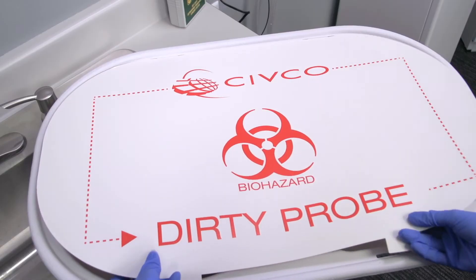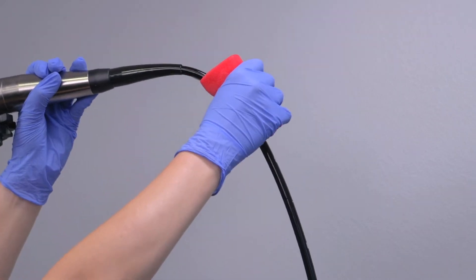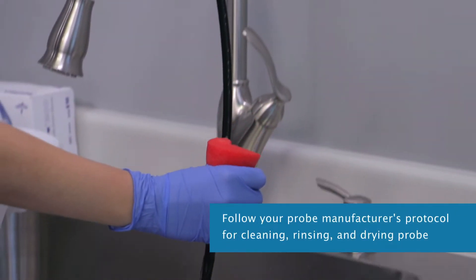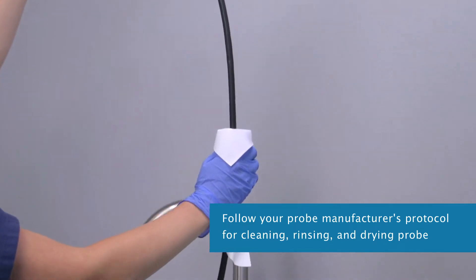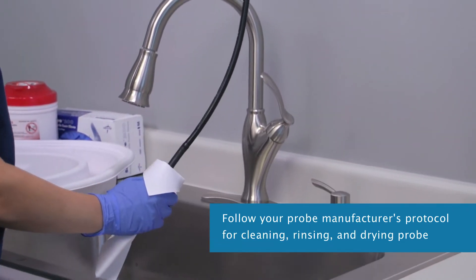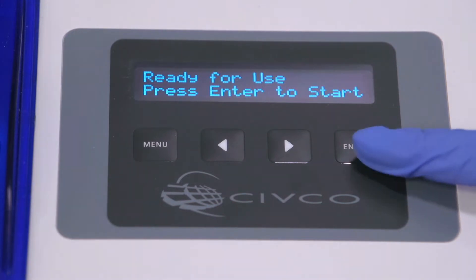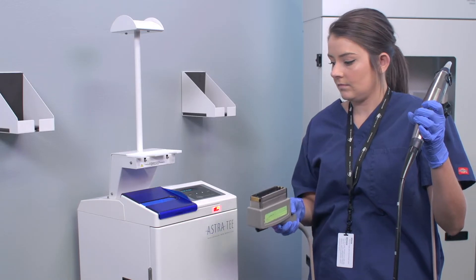For daily use, disinfect your TEE, endovaginal, and endorectal probes following your manufacturer's protocol for manually cleaning, rinsing, and drying your probes. Once ready to disinfect in the Astra, the display switches back and forth from 'Ready for Use' — press Enter to start — and 'Ready for Use' showing the date and time. Scan the probe connector.